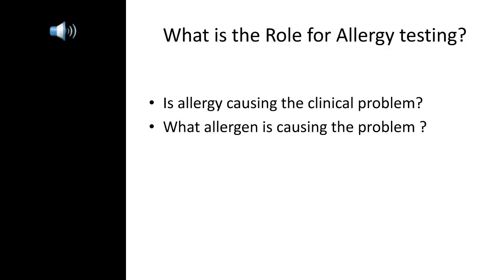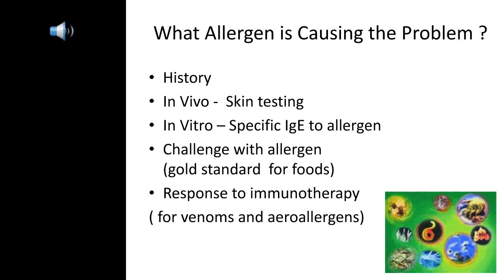Now, why do we do allergy testing? Well, there's two reasons. Firstly, we have to say, is allergy causing the clinical problem? And what allergen is causing the clinical problem? The second question is the most common question which gets asked. And there's a lot of different ways in which we can prove or disprove that allergy is causing the problem, and the historical history is the key in terms of the association of that allergen with the clinical symptoms.